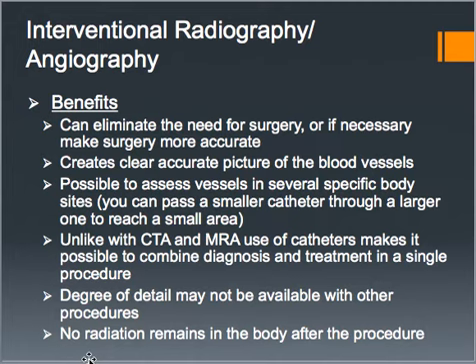One of the other things is no radiation remains in the patient's body after the exam. It is still a larger dose, because it's fluoroscopy, which is continuous and live, and they're using quite a bit of radiation to follow that guide wire and put the contrast in throughout the procedure. But like I said before, X-ray usually has no side effects. I mean, there is always the risk of increased cancer and cataracts down the road from a lifetime dose. But there are truly a lot of benefits to angiography, and the one above all is simply eliminating the need for surgery.